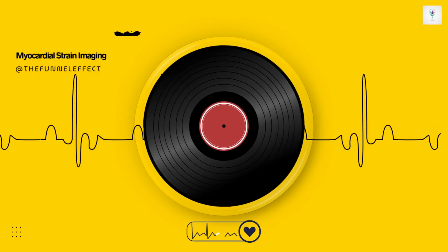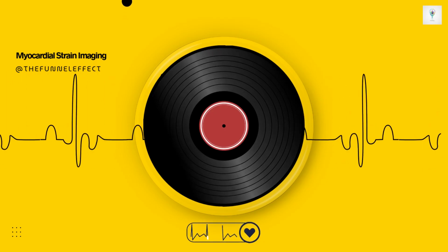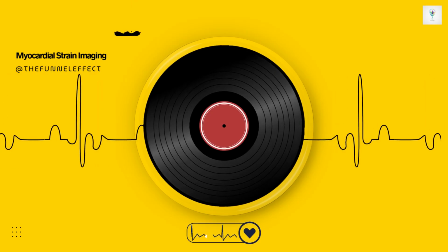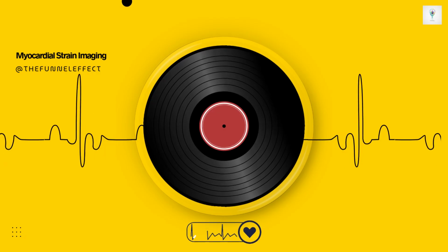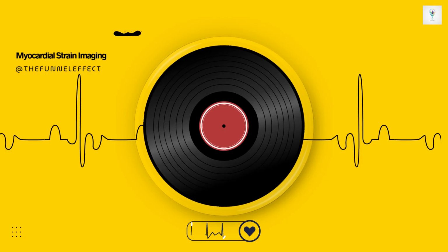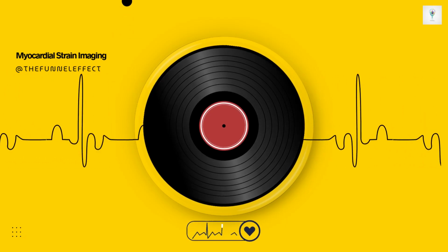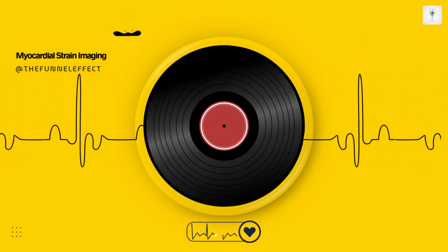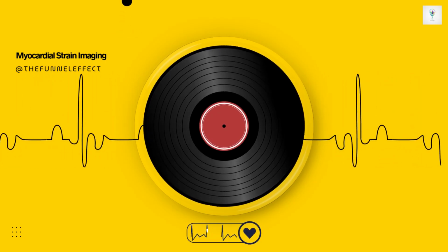Okay, so if tagging was the validation standard, what's the main CMR technique people actually use in clinical practice today? That would definitely be CMR feature tracking, or FT. It's become really popular mainly because it's much simpler to implement. How does FT work? It's essentially a post-processing step applied to the standard SSFP images, the routine bright blood moving pictures of the heart that almost every patient gets during a CMR scan anyway. The software tries to track small image features, mostly focusing on the movement of the inner border of the heart, the endocardial contour. So it uses existing images, which makes it easier than doing dedicated tagging sequences.